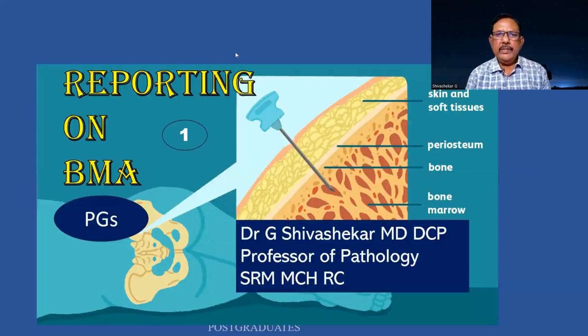In one of the feedbacks that I had received from you, a student had earnestly asked me to explain the bone marrow reporting. I had taken this diligently and have started preparing a series of this bone marrow reporting. It will not be replacing your entire hematology, but then our approach to a bone marrow reporting. So this will be the slide over here.